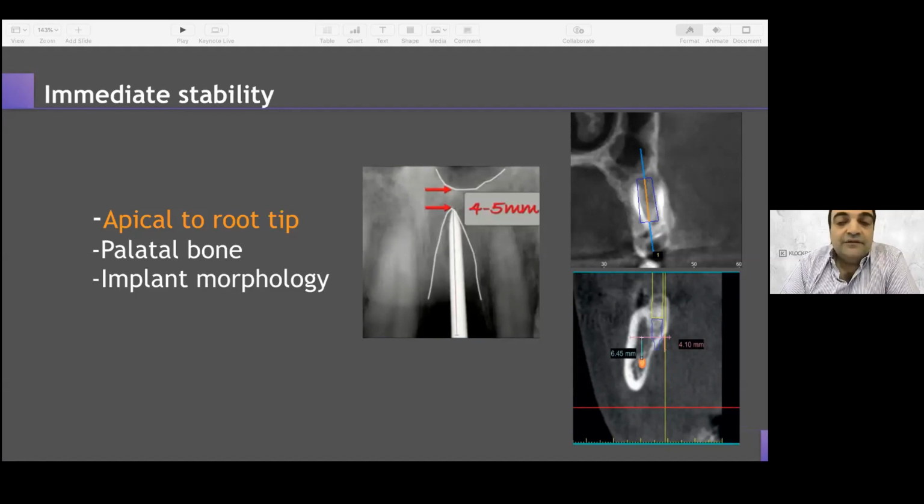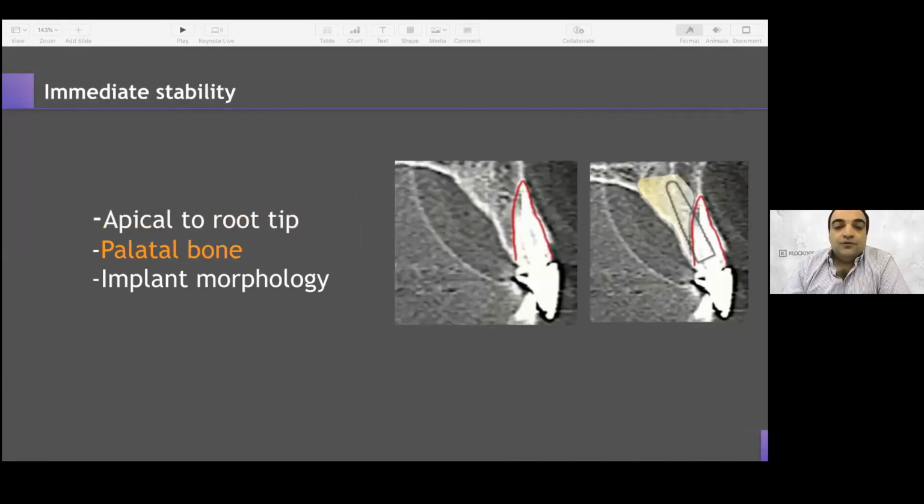And there's a lot of studies with high survival rates of implants done by this technique. At the mandible, we have to locate also our nerve, not to injure it during our preparation, and we have to check if there is a lingual concavity, not to have perforation during our preparation also.